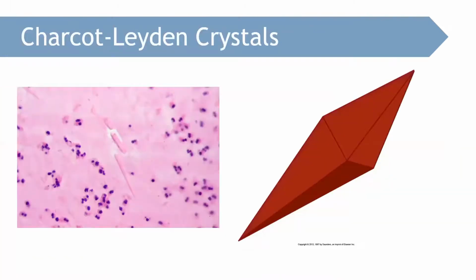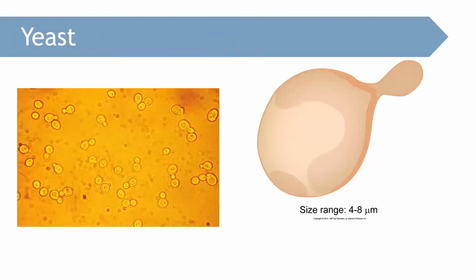This one is Charcot-Leyden crystals. Remember, guys, that the presence of Charcot-Leyden crystals is the breakdown of eosinophil products. This can indicate an immune response of unknown origin, and it can also be misidentified as larvae of a parasite. Yeast, like this, may resemble a protozoan cyst. However, it differs from the protozoan cyst because there are no internal structures. And of course, yeast has buds, or budding yeast.